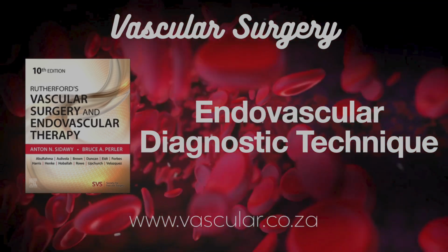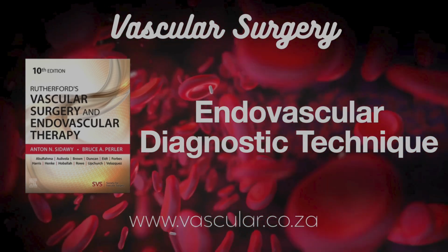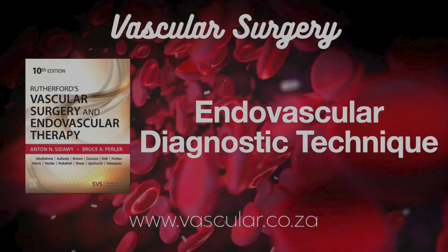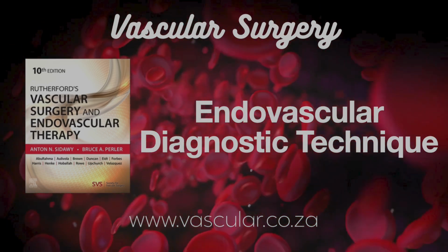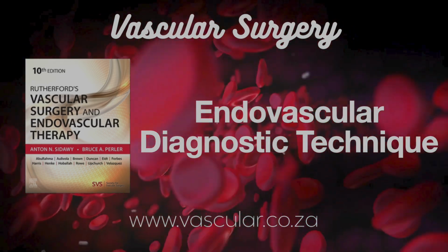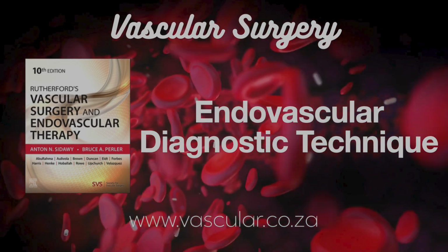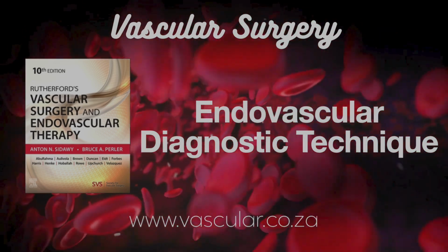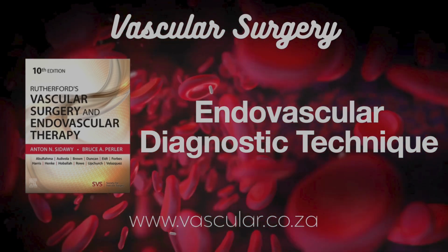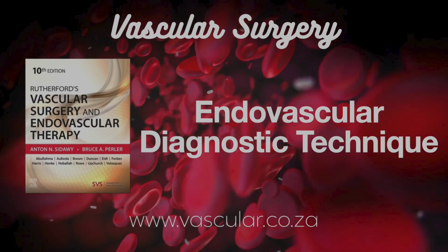And guiding catheters, how do they fit in? Think of guiding catheters as basically sheaths, but with preformed tip shapes like selective catheters, different lengths, curves available. What's the key difference? They maintain a constant inner diameter all the way to the tip. This allows you to pass smaller catheters, wires, balloons, stents smoothly through them. So mostly for interventions. Primarily, yeah. They provide that stable, larger bore conduit right up to the target vessel. Less common for just diagnosis because they're bulkier than standard diagnostic catheters.